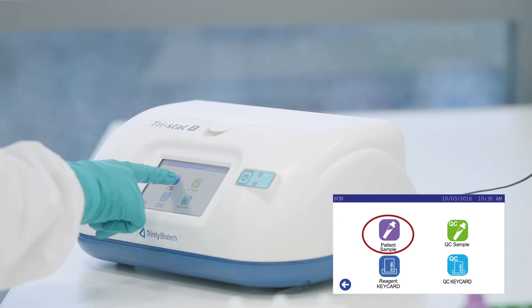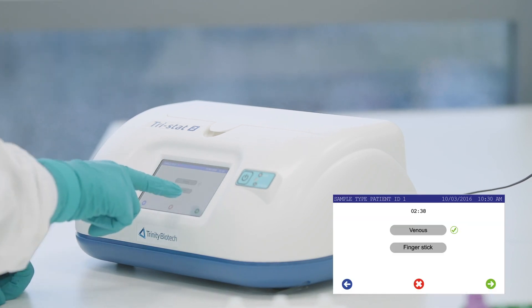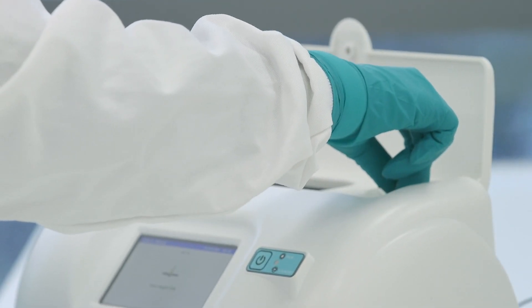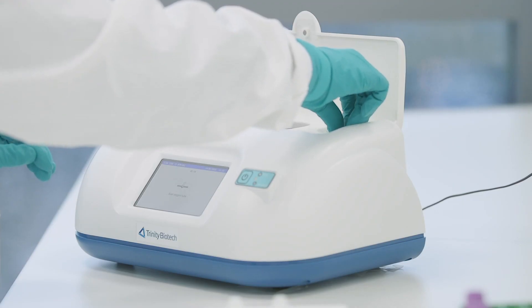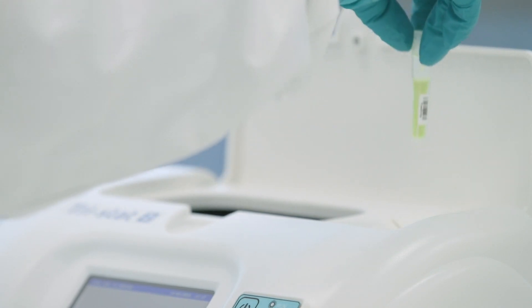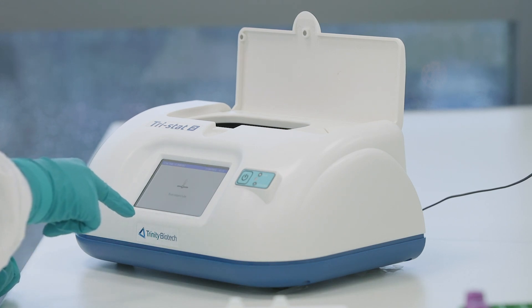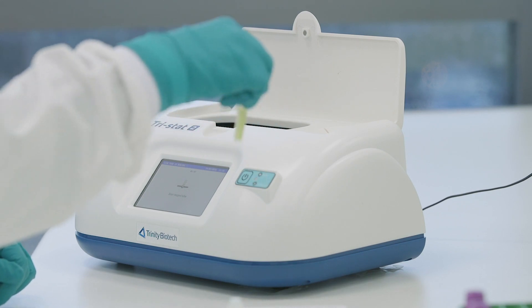Next, press Patient sample. Input the patient ID and select which source the sample is from, venous or finger stick. Lift the lid and place the tube into the scanner with the barcode facing towards you. Rotate if necessary until the success message appears. Place the tube into a test position with the barcode facing the back right corner. Press the green icon to add another reagent tube and repeat this process for a second and third tube.